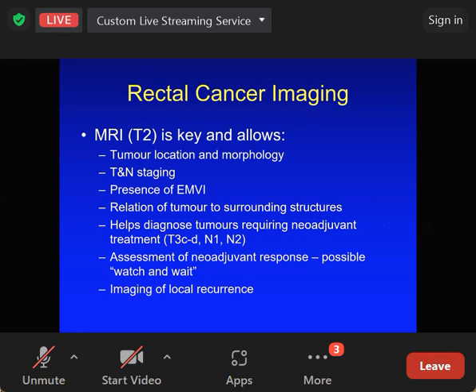Oh, thank you, sir. Two questions. One is from Hussein Rumi. How reliable is CT abdomen to rule out or rule in ischemic bowel in hypertensive patient?